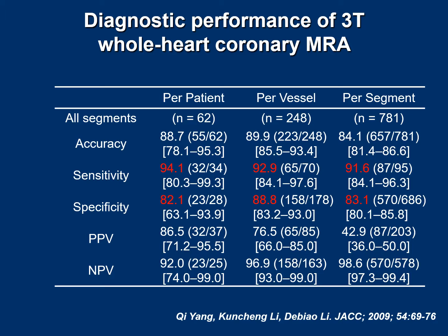The diagnostic performance of 3T whole-heart coronary MRA is comparable with 64-slice CT angiography. On a per-patient level, the sensitivity is 94.1%. On a per-vessel level, the sensitivity is around 92.9%.